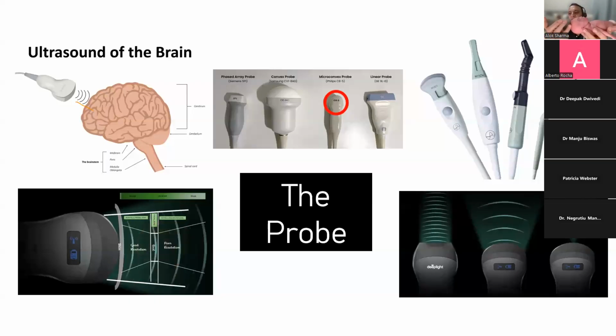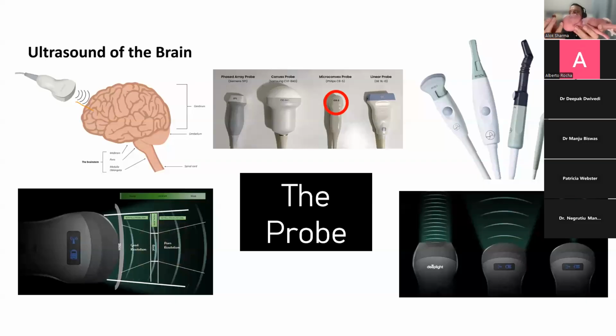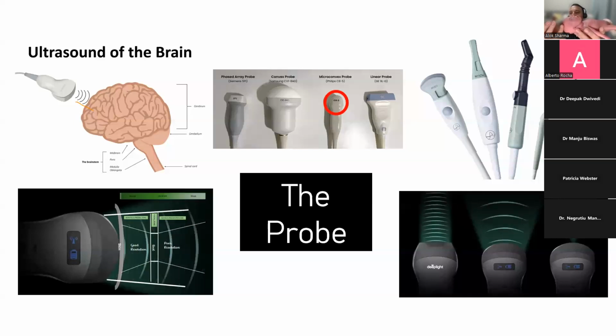That's telling me it's right-sided. But actually, once I've achieved my best image, this finger is going to stay here and it's going to support everything. We're not going to move. And what we're going to do is we're going to have very slow movements. Okay. And the game that we play is called statue.